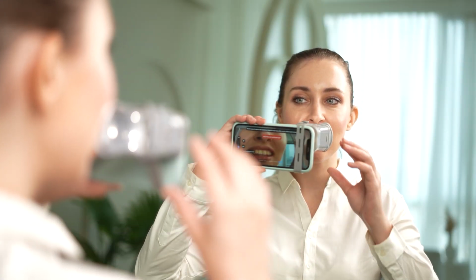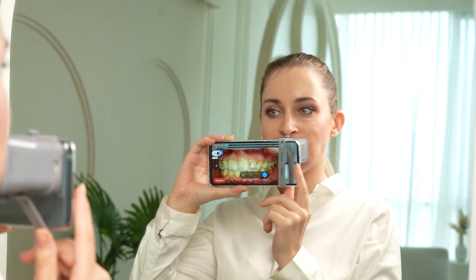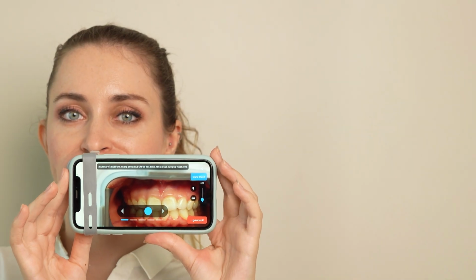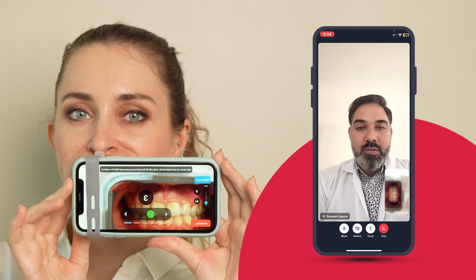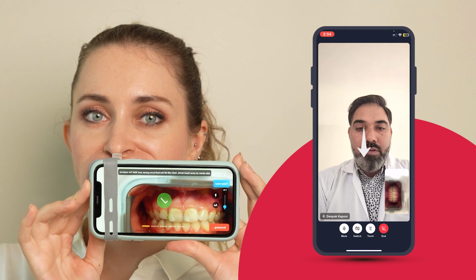Your dentist would want to evaluate your teeth from different angles. To make this simple, your dentist will initiate an audio and on-screen guide while also continuously guiding you on the next steps. Switch to your back camera. Wear the iScope 360. Your teeth should be bright and perfectly centered. Your dentist will capture your teeth in 5 different views. First is the front view, which will be your default position after wearing the iScope 360.